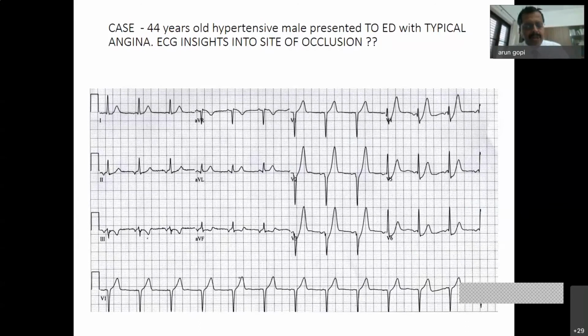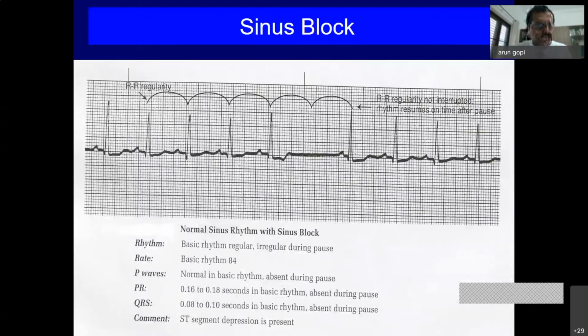Okay, so I think we have discussed acute coronary syndrome, and since there's shortage of time, I won't go into rhythm disorders, because that itself is a big topic. I'll just say one common thing that most physicians should know, where ECG is very specific: an electrolyte disturbance, what we call hyperkalemia. I'll end with this entity where ECG is sure shot in diagnosing an electrolyte disturbance without even looking at the serum potassium values.